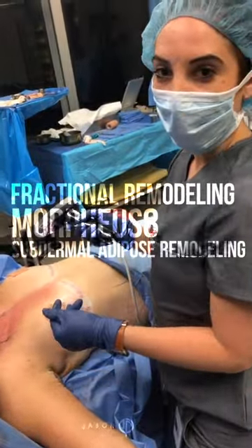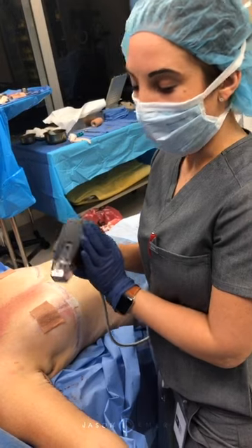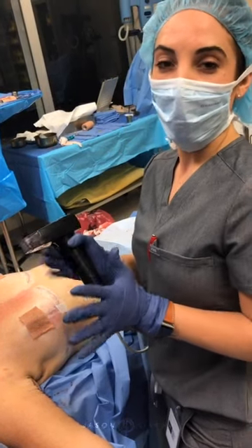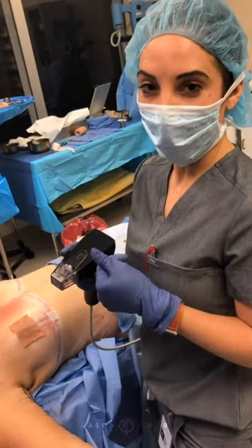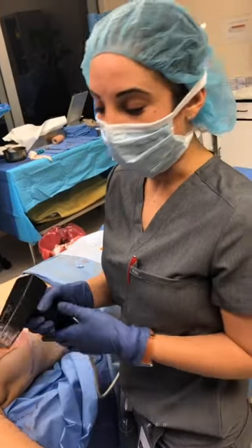Hi everyone, this is Danielle with Dr. Emma's office. We're finishing up our last case for the day. We're bringing in the Morpheus handpiece from InMode. This is the newer and upgraded version of Fractura. It penetrates a little bit deeper, so it's great for tightening on the body.